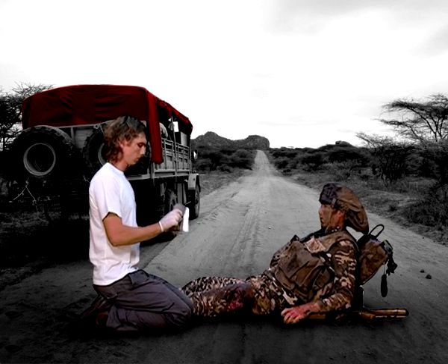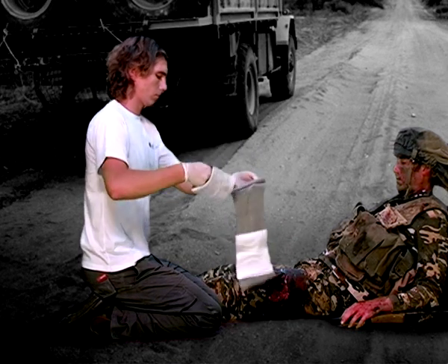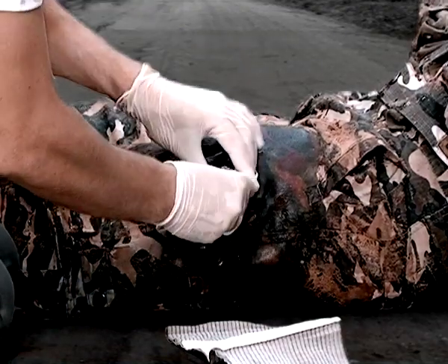The FCP-05 or FCP-07 emergency bandage provides an effective, immediate solution for treating deep wounds. Remove the second mobile pad from the bandage, form it into a ball shape, and stuff it into the wound.